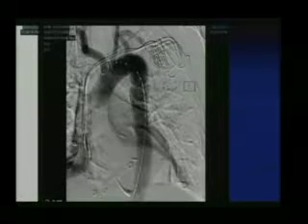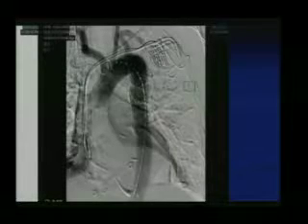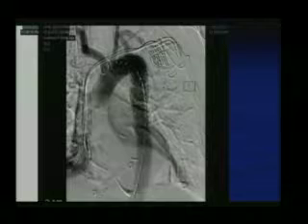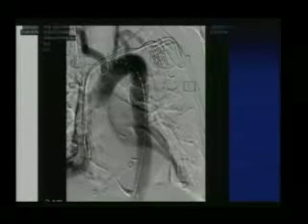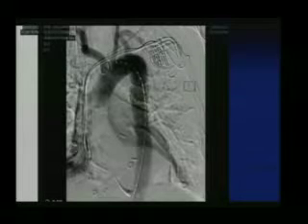Type 2 is if there are any intercostal arteries or lumbar arteries or IMA below that are feeding the aneurysm, or it's leaking around. So that's a type 2 endoleak. Type 3 endoleak is, so this is a one-piece case. One-piece case means you just deployed one 10-centimeter stent graft. If you're using multiple stents, if you're bridging, like if you're overlapping 2 stents, and it leaks in between those stents, that's a type 3 endoleak.